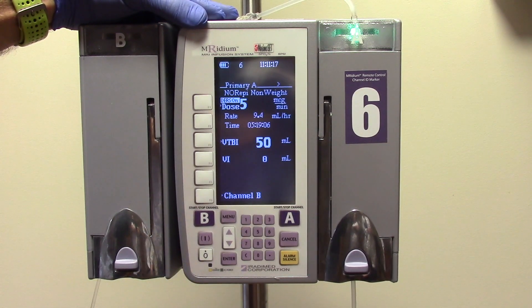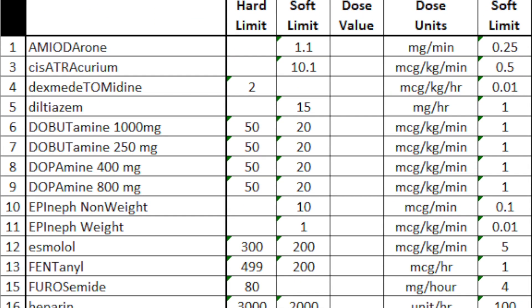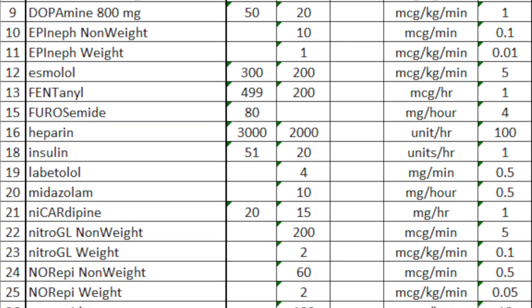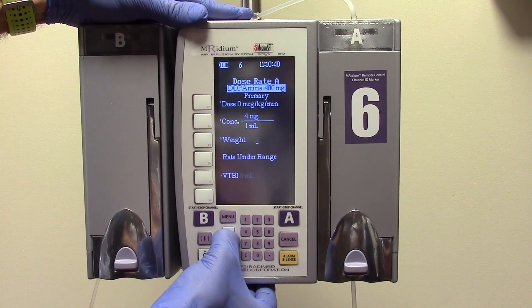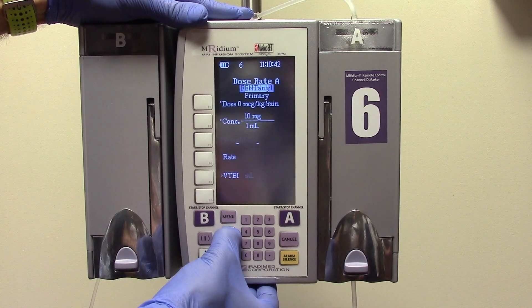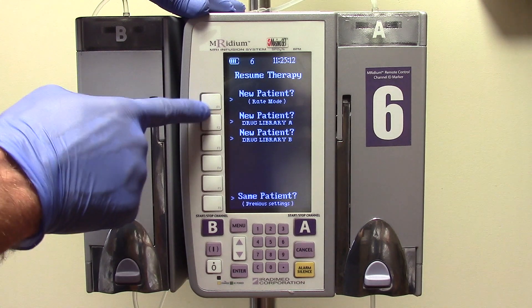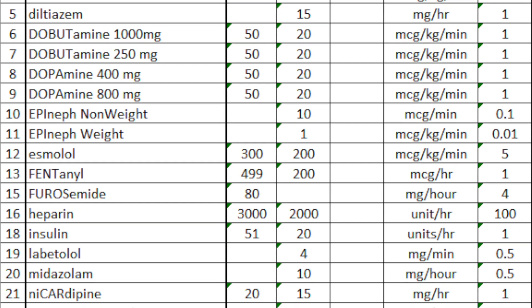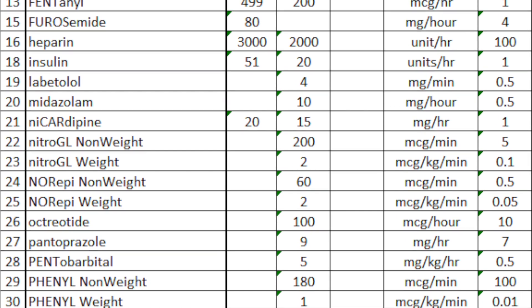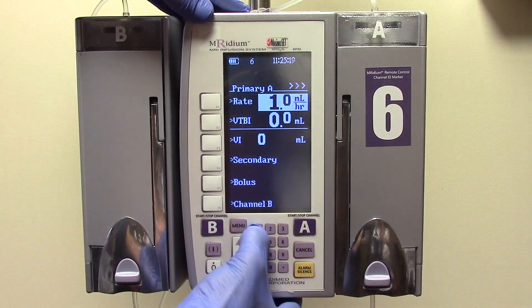A complete medication library list is attached to the MRI IV pump pole. It is possible that occasionally you will infuse a medication that is not in the MRI pump medication library. In these cases, you will have to use the rate mode. However, because rate mode does not have safety guardrails, it should not be used to infuse medications that are already in the library. If using rate mode, enter the rate and the volume to be infused.